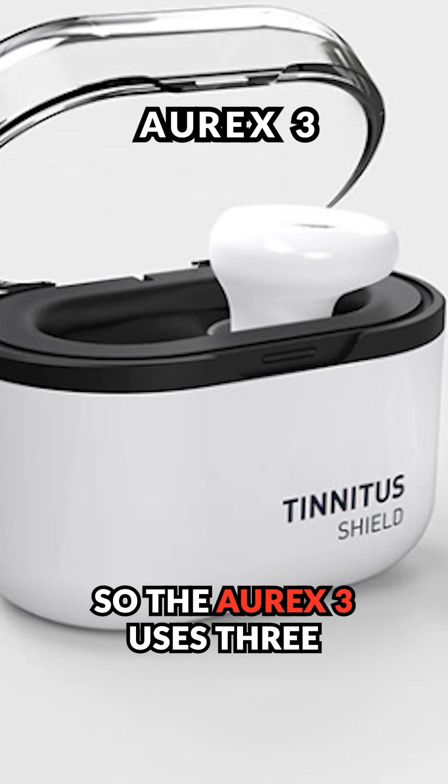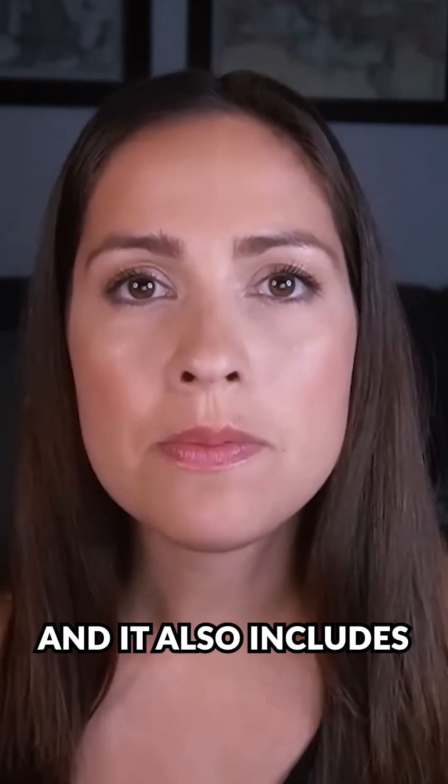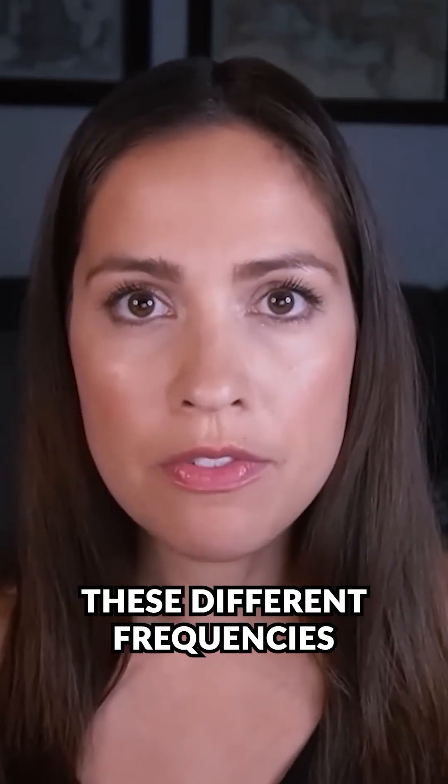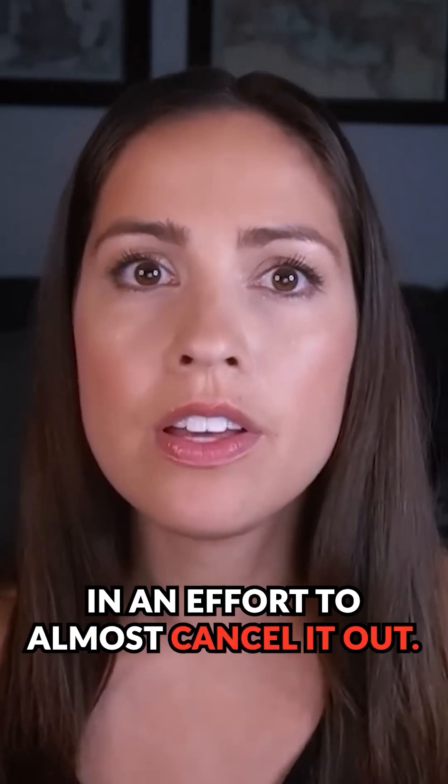The Aurex 3 uses three different fundamental frequencies and also includes some side frequencies. The combination of all these different frequencies produces a complex sound signal that's meant to somewhat match your tinnitus in an effort to almost cancel it out.